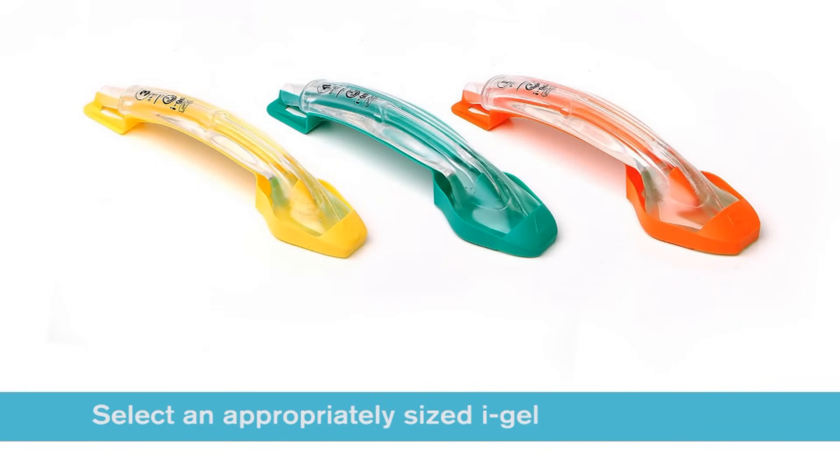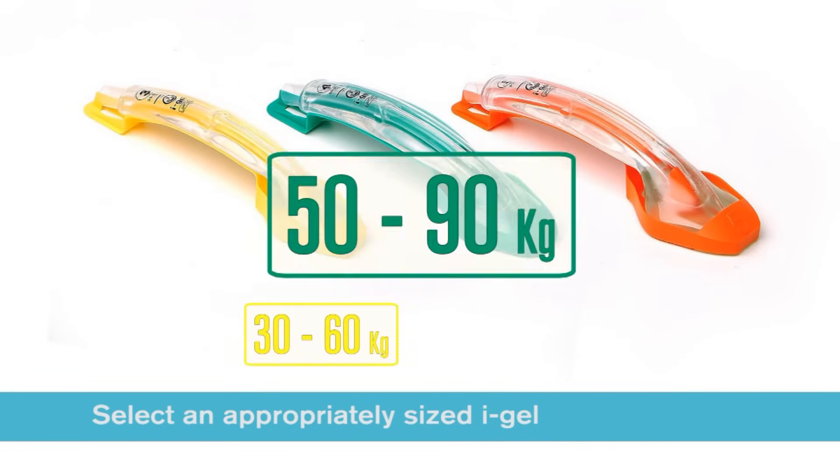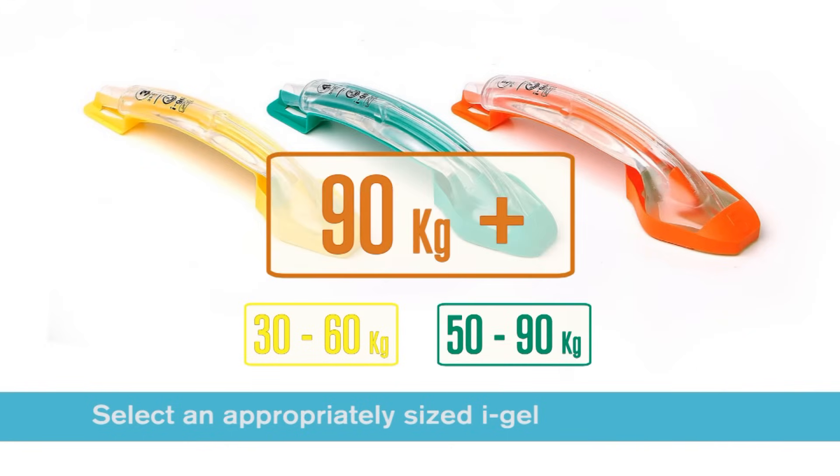Select the appropriate size iGel according to patient weight. For patients between 30 and 60kg, a size 3 should be selected. For patients between 50 and 90kg, a size 4 should be selected. And for patients above 90kg, a size 5 should be selected.